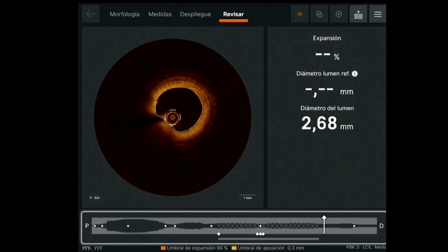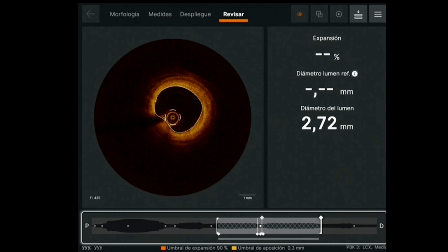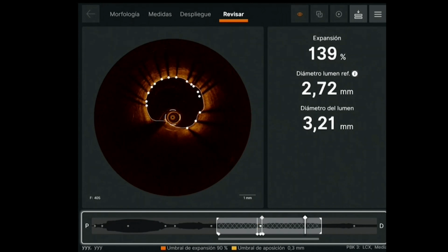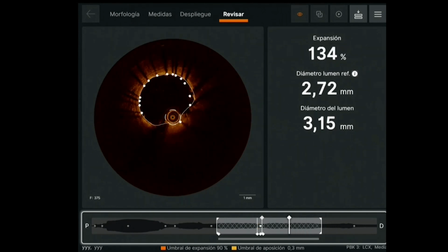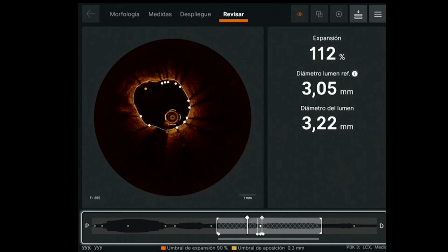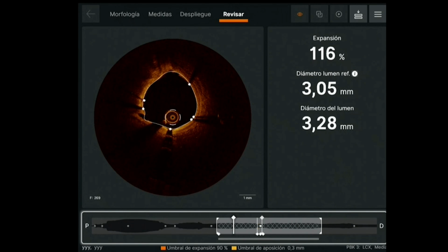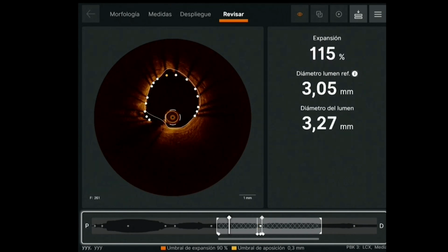I think I agree. The other aspect, of course, is that we see that the matching of the size of the vessel with the stent was perfect. You can see that there is virtually no difference whatsoever between the size of the lumen and the stent area immediately at the edge of the stent. Yeah, so it's really good. And as you say, you really have to understand that in these types of vessels, first presence of calcium, second bends, etc., there is always a few struts that will not be fully opposed, and it will not be possible to correct that. So it's probably not relevant. It's a very good point.